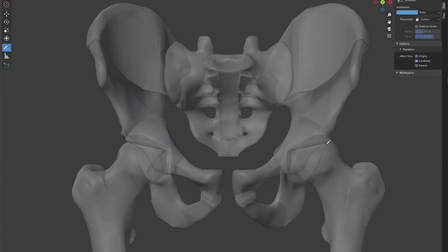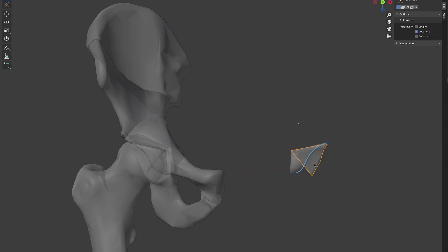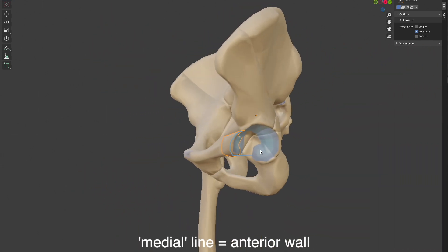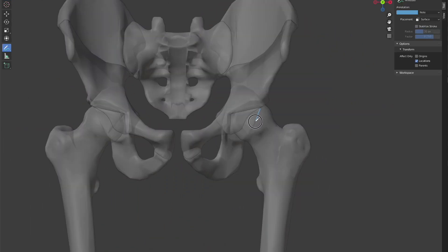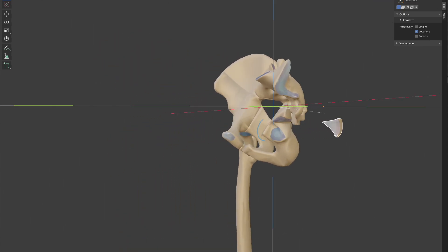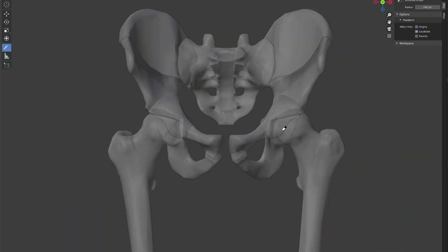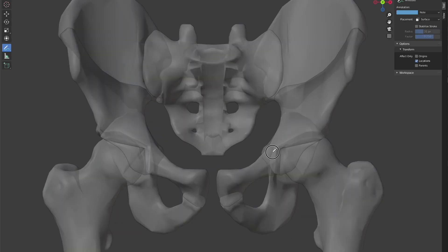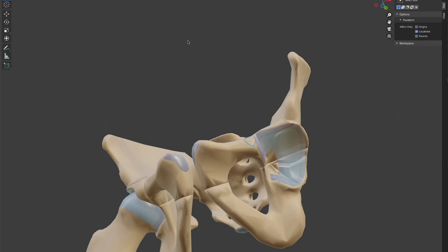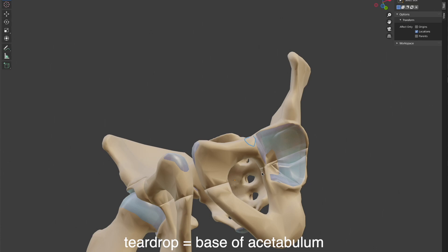The next two lines delineate the anterior and posterior walls of the acetabulum. The more medial line refers to the lateral edge of the anterior wall, while the more lateral line refers to the posterior wall of the acetabulum. Finally, there is a teardrop shape visible medial to the proximal femoral head on the AP view. This teardrop shape represents the thin wall that forms the base of the acetabular cavity.